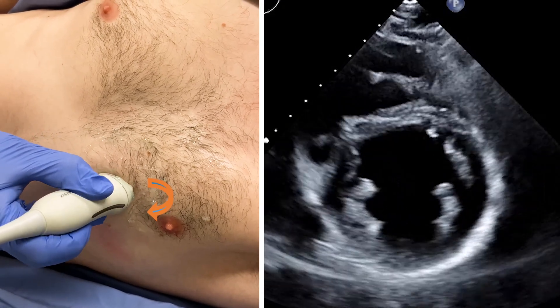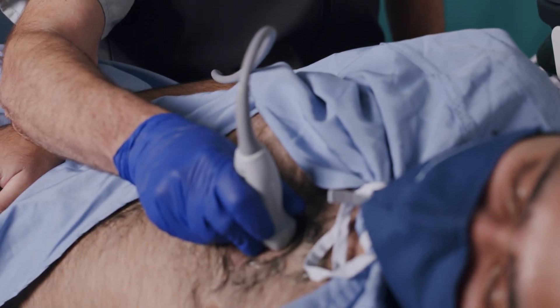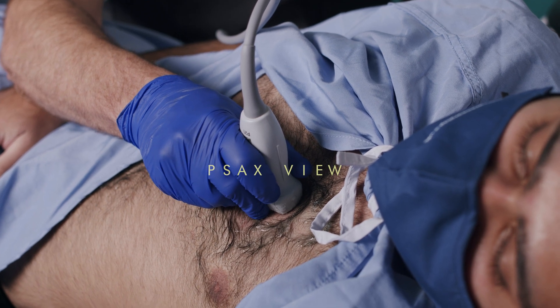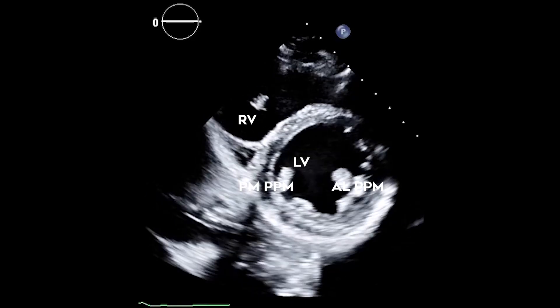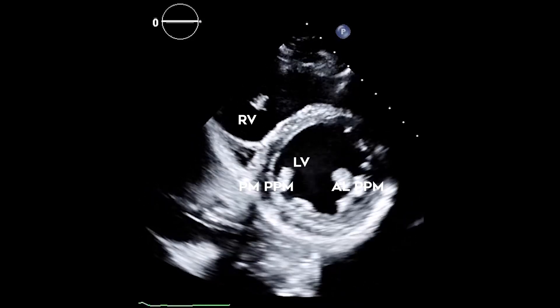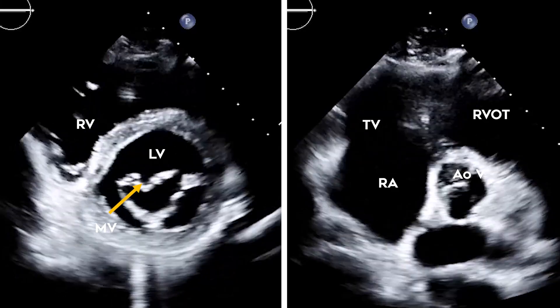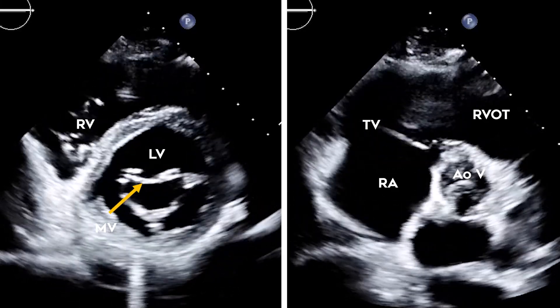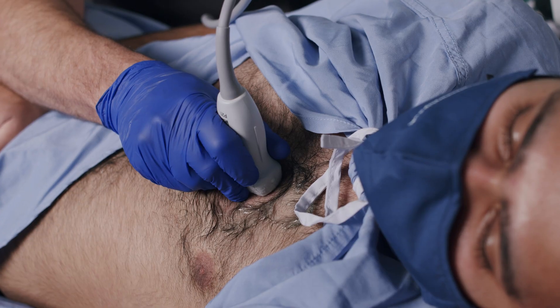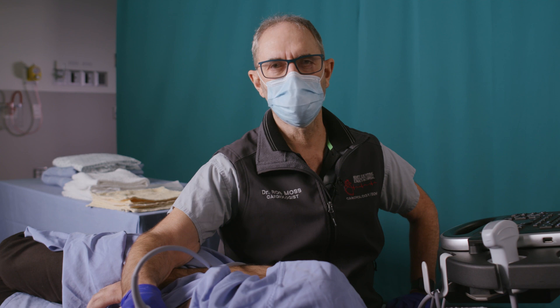Once we have determined a good window for the parasternal long axis exam, it's relatively straightforward to obtain the parasternal short axis view. Occasionally you may have to slide to a lower intercostal space while maintaining the same orientation of the probe marker. If you are appropriately centered over the mid-left ventricular cavity, you should see the two papillary muscles, which appear as rounded structures in the short axis view. If you are seeing the mitral or aortic valves, you are not in an optimal POCUS short axis view, which is at mid-ventricular level. This is a good view for assessment of left ventricular function, relative left and right ventricular size, and septal position.